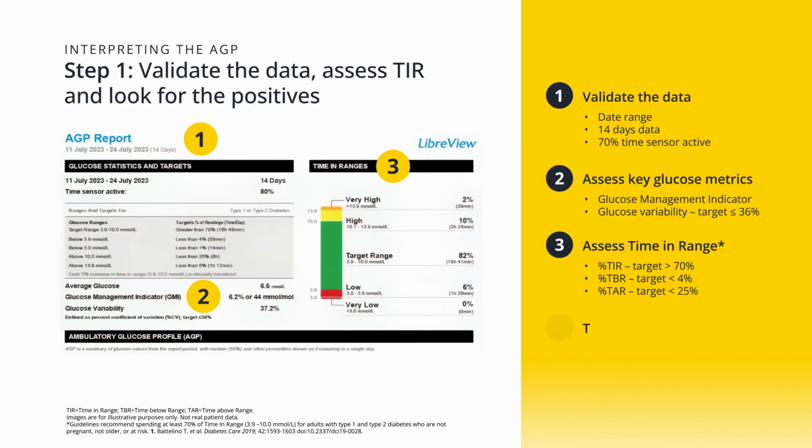Before focusing on areas that need attention, do congratulate your patient on any improvements and positive changes that you have noticed since your last review for an encouraging start to a consultation that supports effective and open discussion.